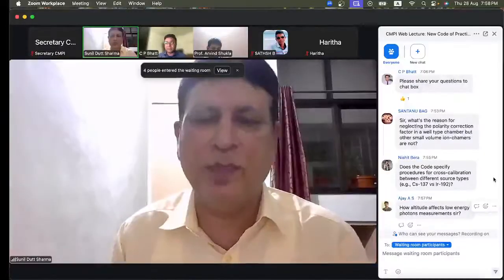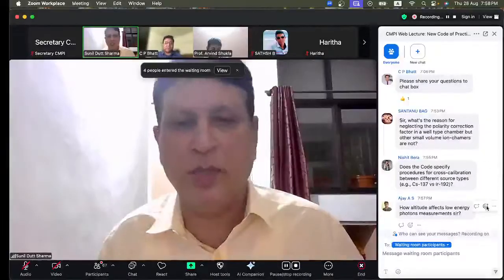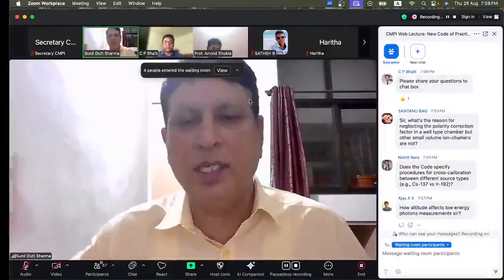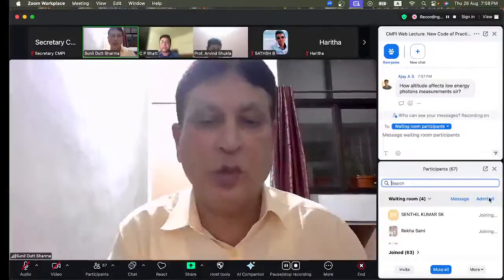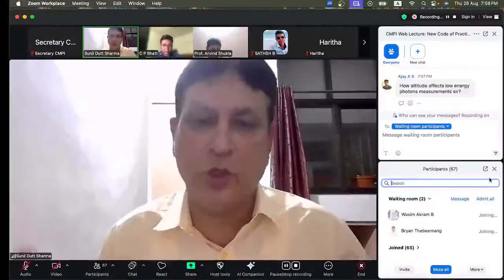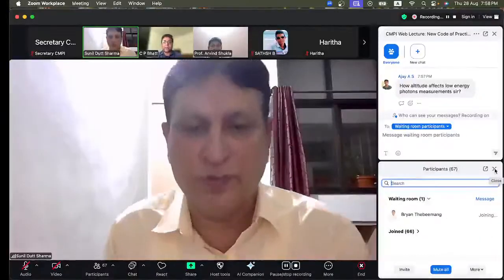So say, for example, if I am having a calibration against a given source model of iridium 192, I can do cross calibration with another model of iridium 192, but I cannot switch over from radionuclide iridium 192 to cobalt 60 or cesium. This is not allowed as of today. We do not have this much information in hand as of now.